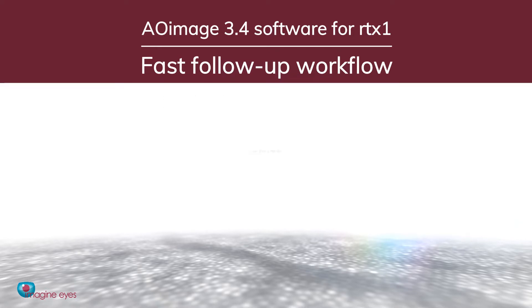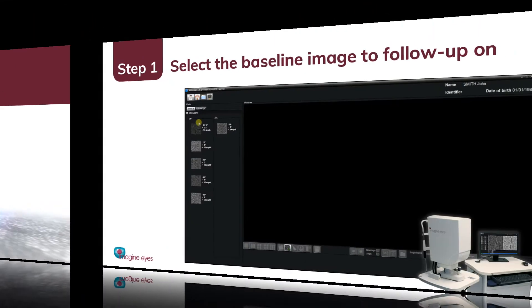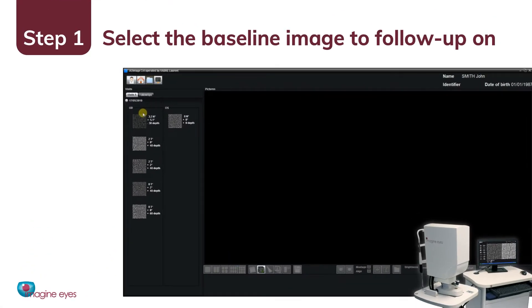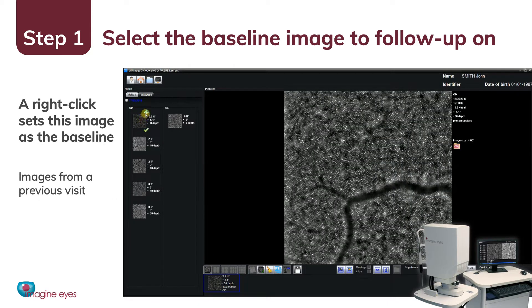The follow-up is done in less than a minute in two simple steps. First, select the baseline image that you want to follow up on among images from a previous visit. A right-click sets this image as the baseline.